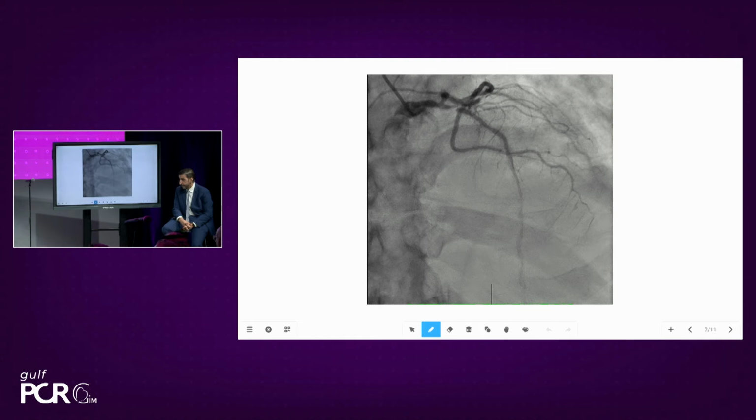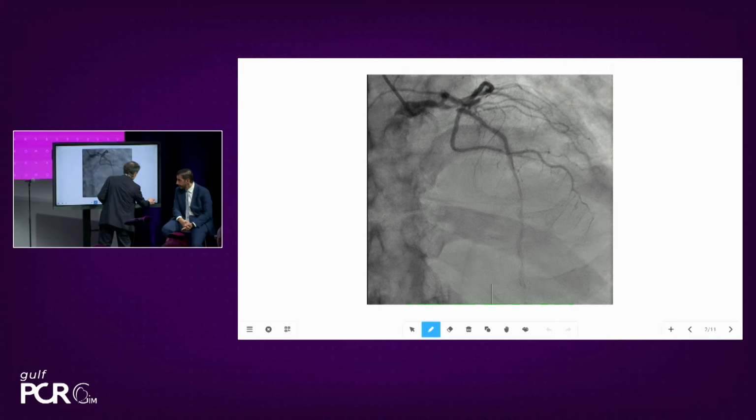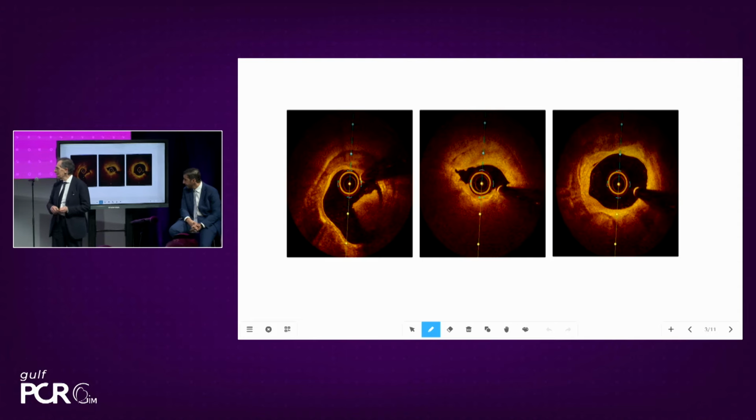You can see the proximal lesion. You can see the diffuse disease. What we are going to do is try to bring you into a different world, using the imaging from inside to get an understanding of what we will do and how to act. For doing this, I wanted to have Dr. Bardouli come to the podium and tell us a little bit about the case that we will talk about.